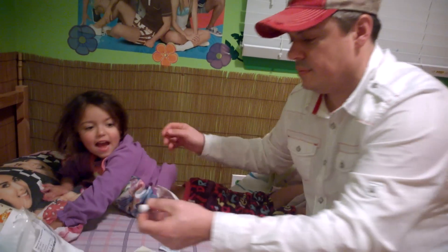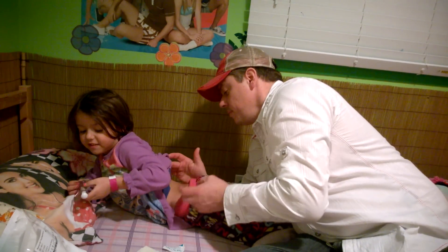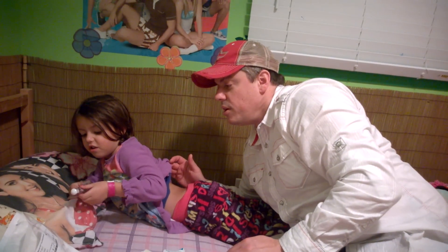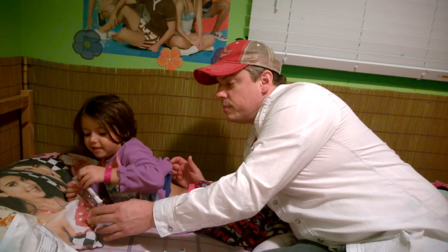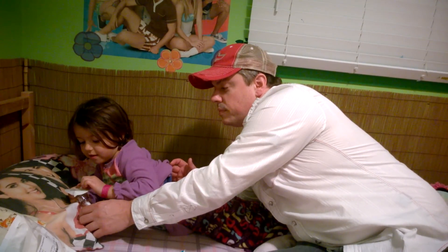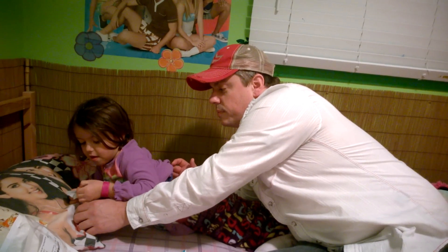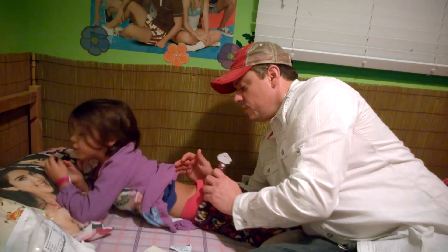Now we're opening this, and this is my thing. So once I have to take this off — you can take it off right now. And I take it off like this.